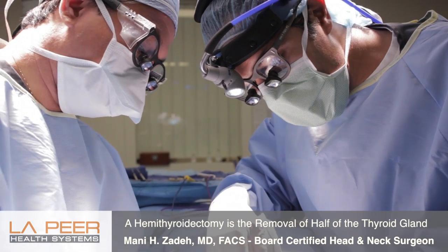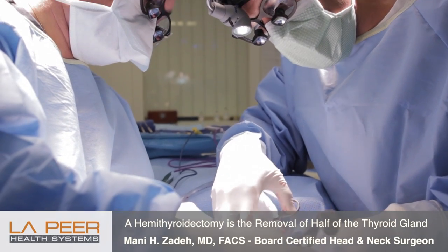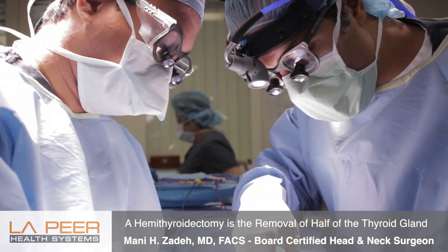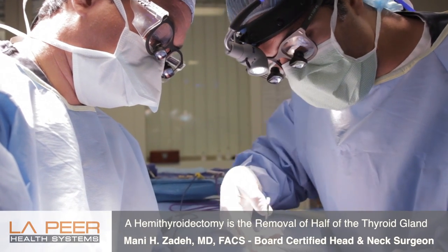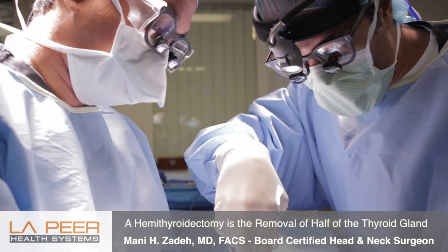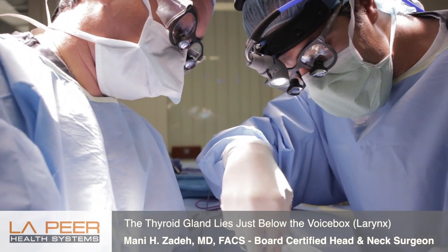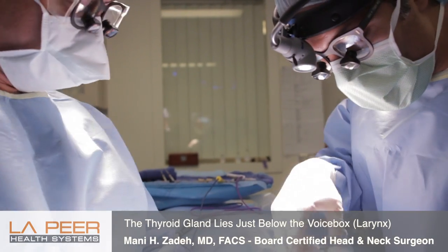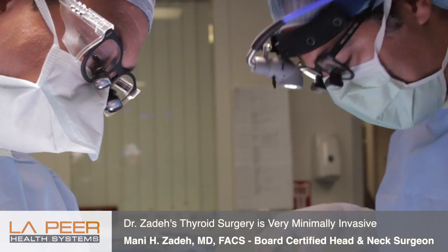We've just dissected the upper part of the thyroid, which is very vascular, so we took away all the vessels. We're separating from surrounding tissue so we can identify the recurrent laryngeal nerve, which is the nerve that controls her vocal cord movement and her speech. Once we have that identified, we can remove the remainder of the thyroid.